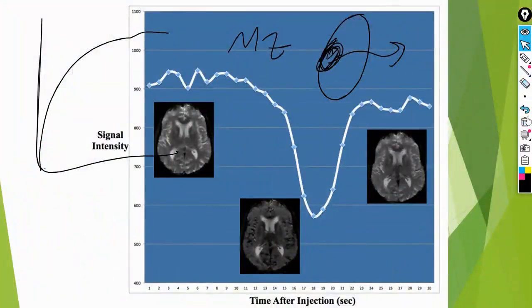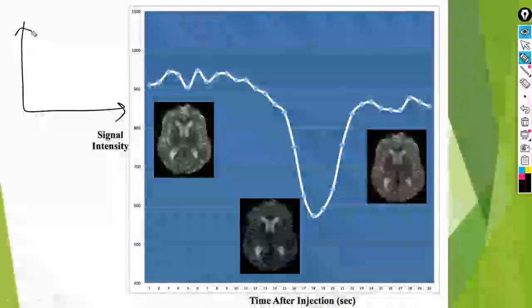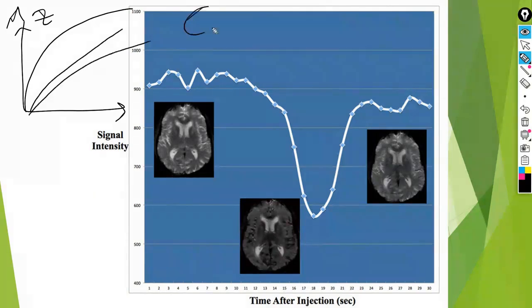All right. Let's focus, everyone, please. Here it is. Here is the MZ. I injected a contrast agent. Did this contrast agent make the MZ of the tumor return quickly or slowly? Quickly. It returns quickly like this. As for the other tissues, they are much slower.